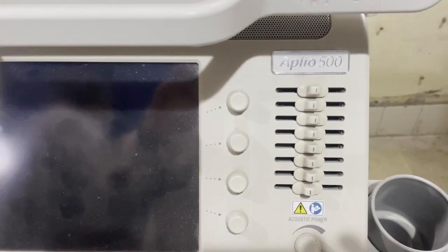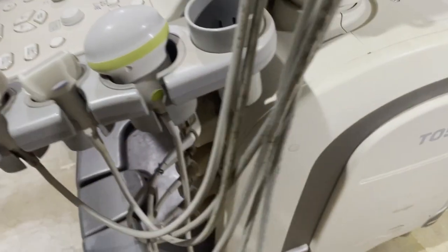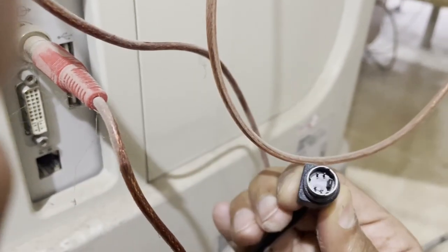Now I will show you physically connecting my ultrasound machine with the software. This is my ultrasound machine — the Aplio 500. I'll show you how I've connected this machine with my PC. We go to the back side of this machine and here you see the different ports. This is the S-Video port — a male connector of S-Video — and we plug this male connector into the female connector of the machine.